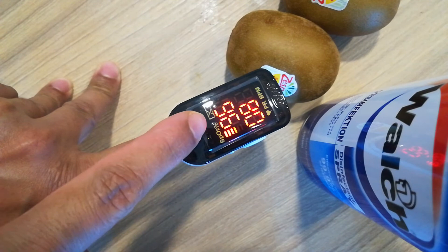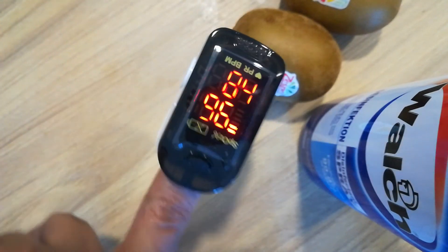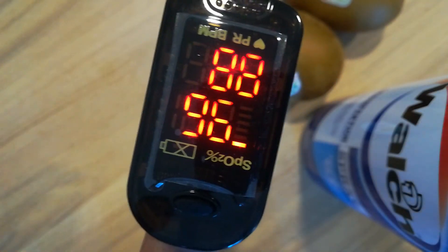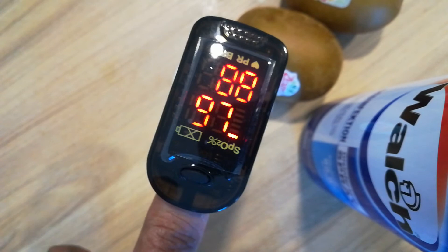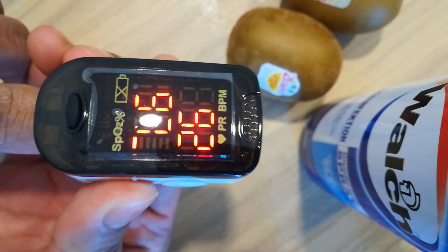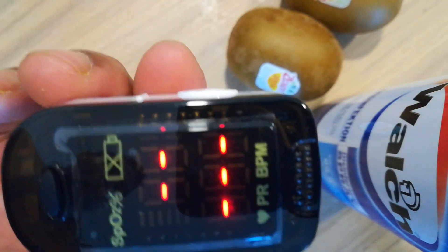Make sure this is 95 to 100 and this is normal. So now I'll keep it off — you can see that it is now off automatically.